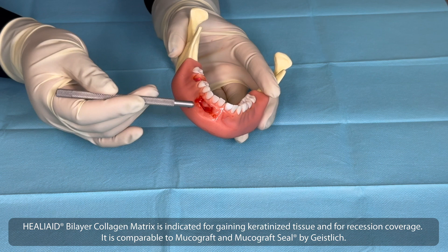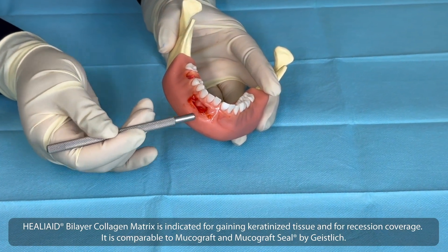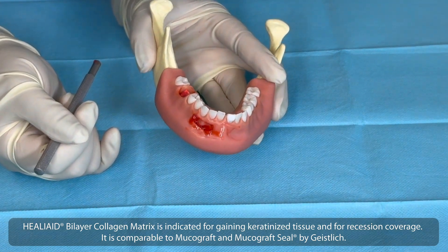HEALIAID Bilayer Collagen Matrix is indicated for gaining keratinized tissue and for recession coverage. It is comparable to Mucograft and Mucograft Seal by Geistlich.